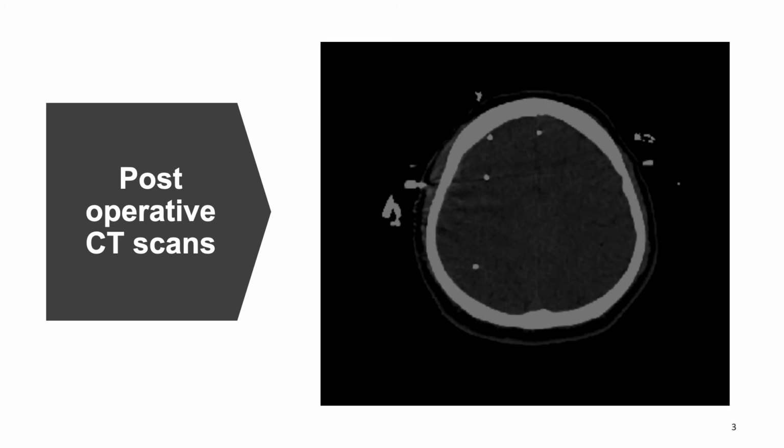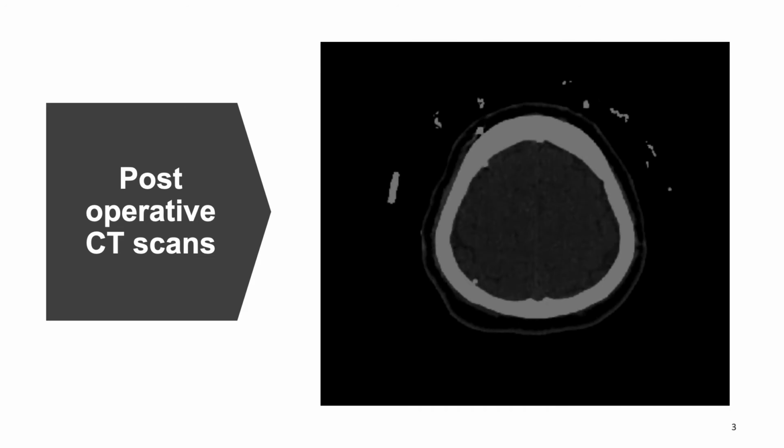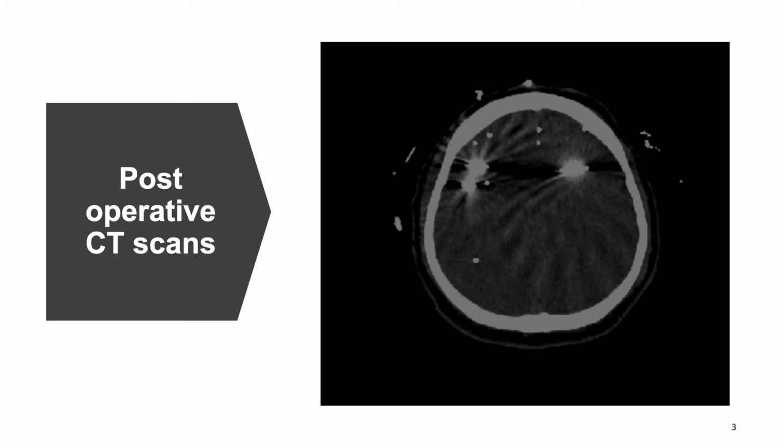or metal structures. However, artifacts from metal intensities or, for example, CT scans with different reconstruction filters such as cone beam CT scans that enhance bone structures, or perhaps overlap of intensities of the electrodes and the bone, do not allow decent automated distinction between brain tissue and electrodes, and segmentation of these structures with existing methods is inaccurate and not fully automated.